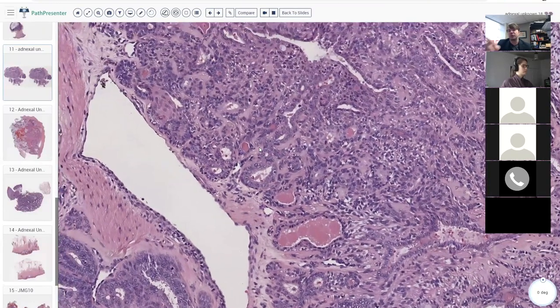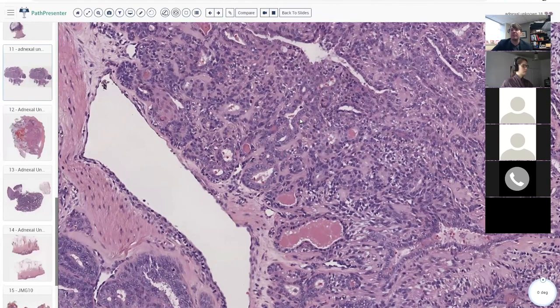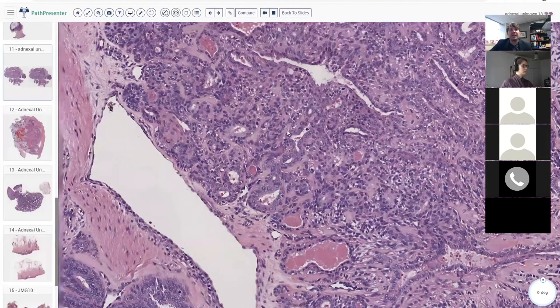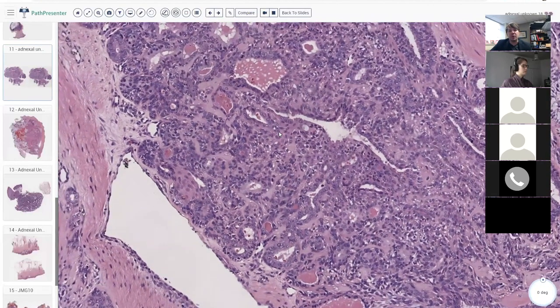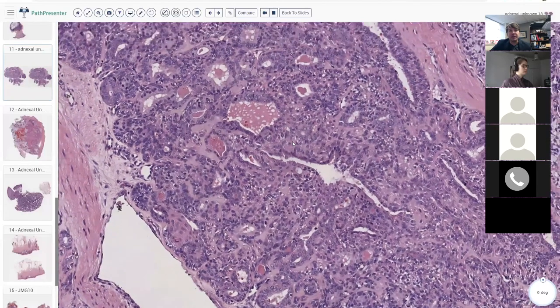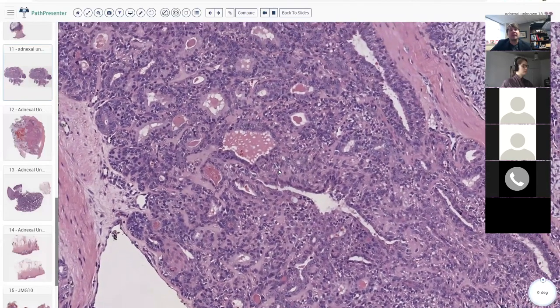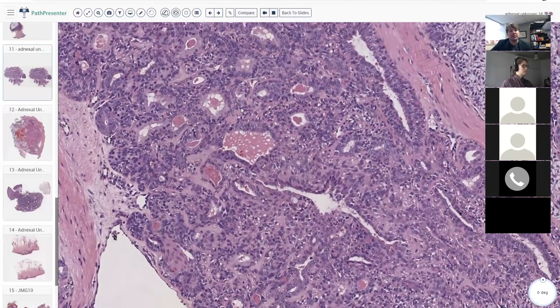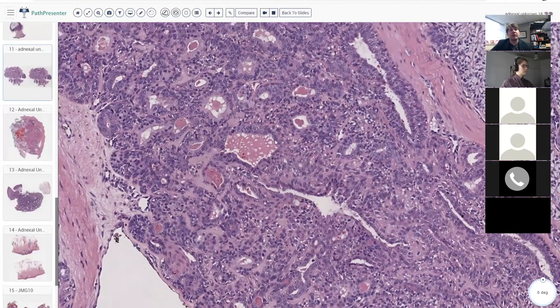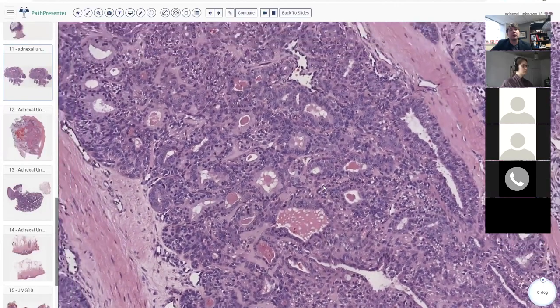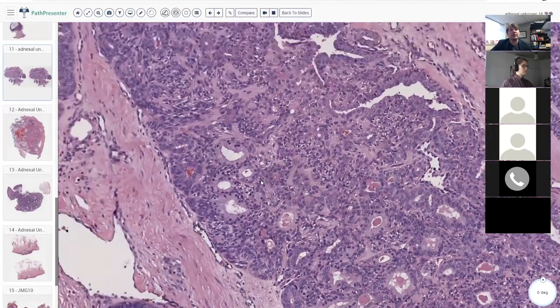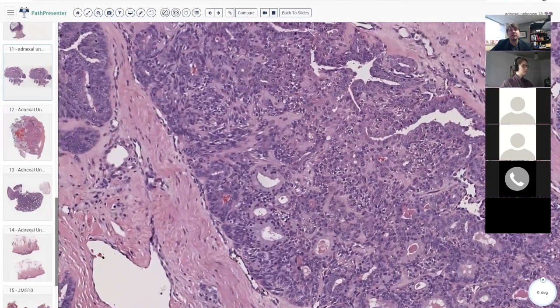Yes, I see that comment about basal cell carcinoma. In the setting of genodermatoses like Gorlin syndrome, you can definitely see basal cells in kids. Here are some more ducts.